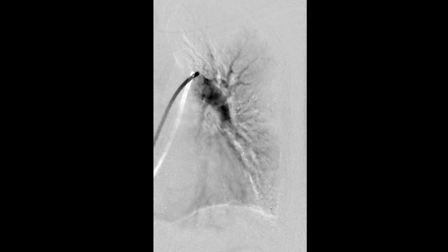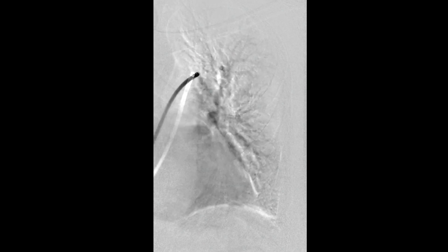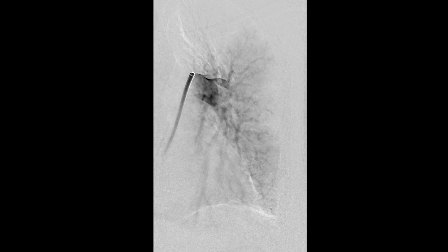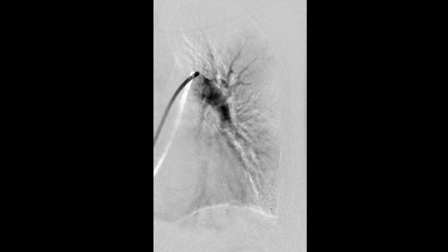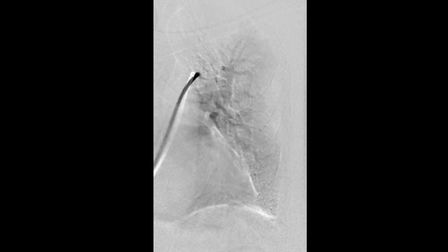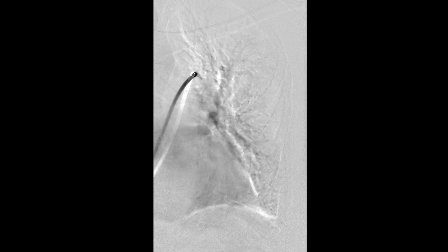Pulmonary arteriogram was performed, which showed filling of the main pulmonary artery as well as its distal branches without any active extravasation. It also confirmed the 7-centimeter wire fragment in the left lower segmental pulmonary artery.